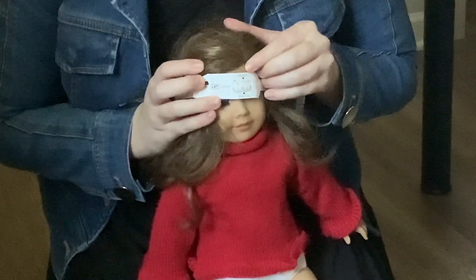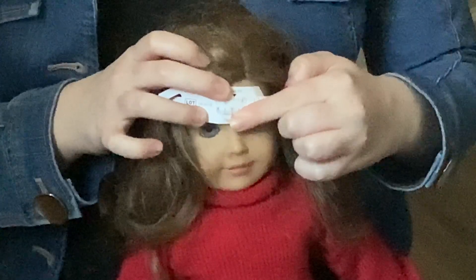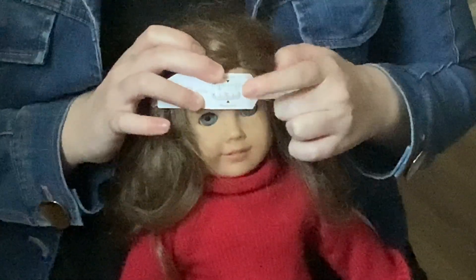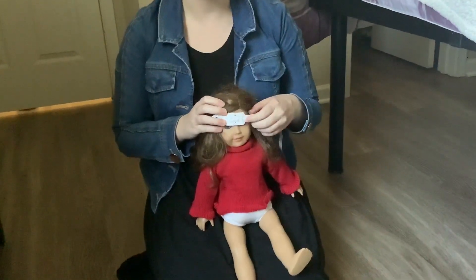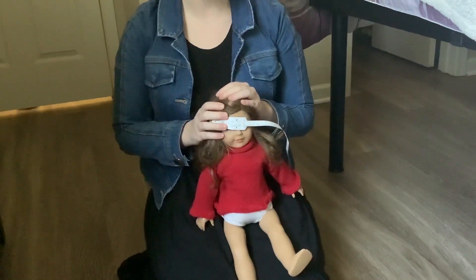To read the measurement, it is the number that falls right between these two triangles on the centimeter side. You are going to want to say that out loud so that the individual conducting your virtual visit can write down the number.